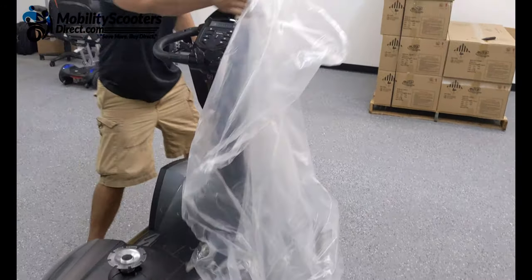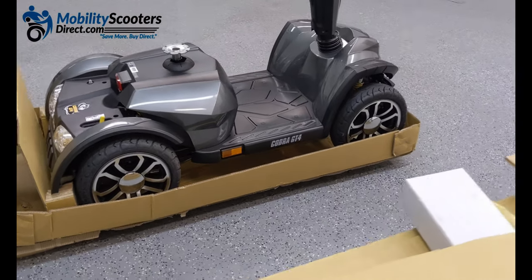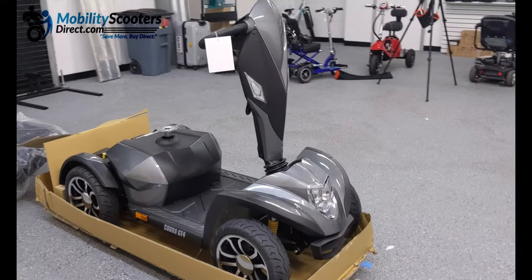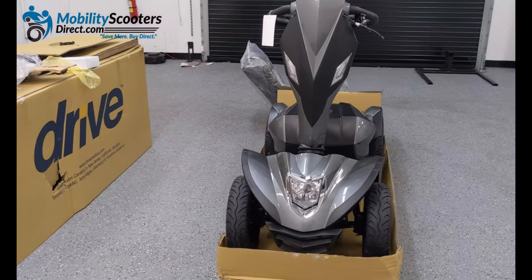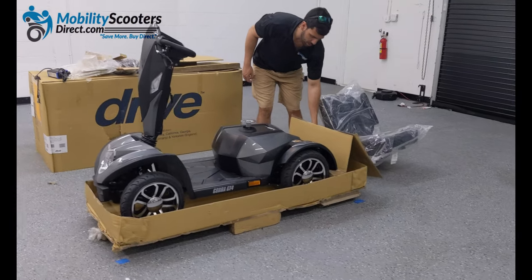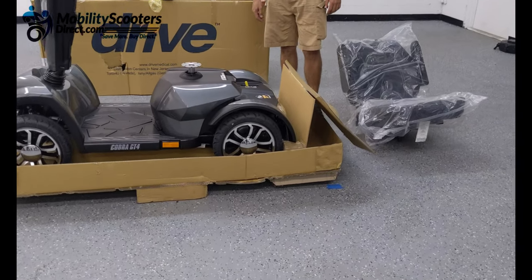As you can see, the Cobra GT4 is a very modern, sporty-looking mobility scooter with full suspension. It comes in a grayish black color, with several panels in a gunmetal gray and also some in a darker black color.